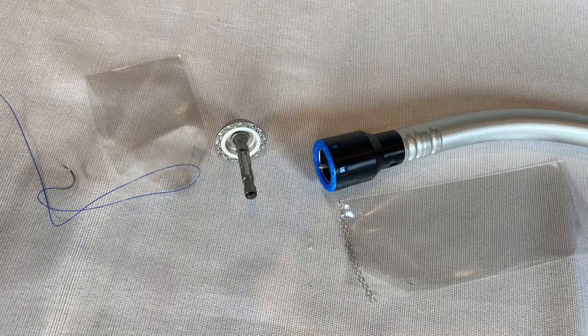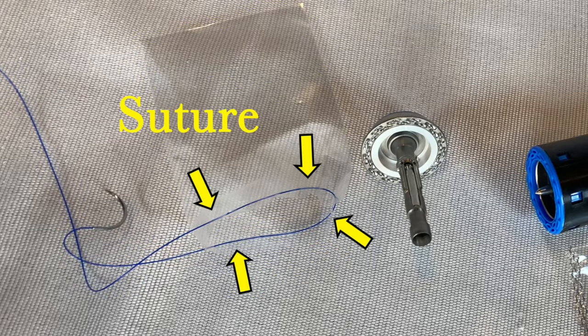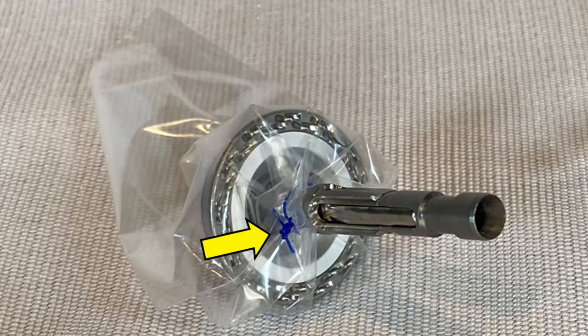Now let's go back to our bag, which simulates our divided bowel without the blood or grossness. Remember, I'm going to take the open end of that bowel and place a suture around it, seen here, and then I'm going to take the anvil and place it up inside that bag, tie the suture around the stem so it's sealed tightly around it.